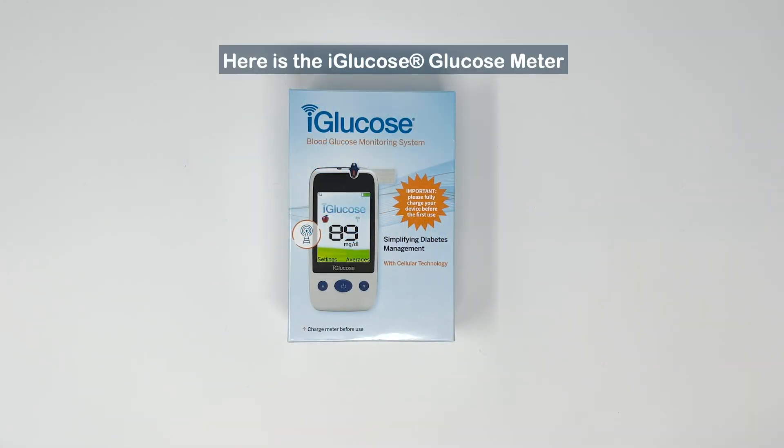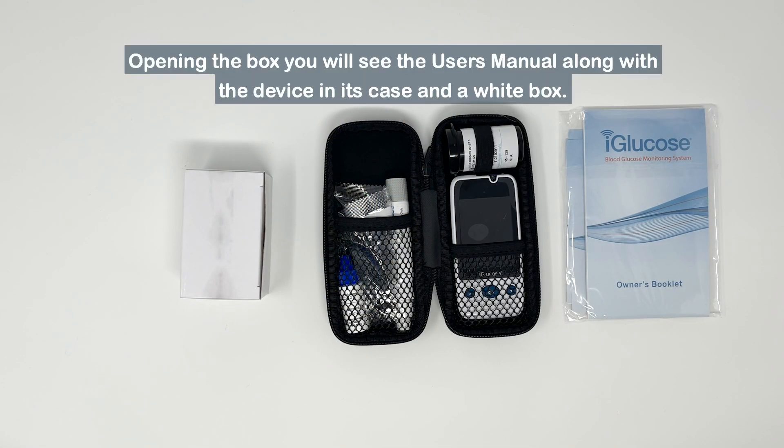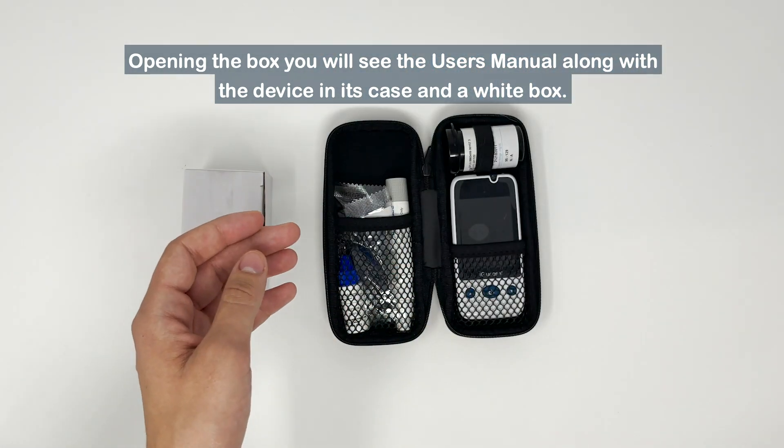Here is the iGlucose blood glucose meter. When you open the box, you will see the user's manual along with the device in its case in a white box.